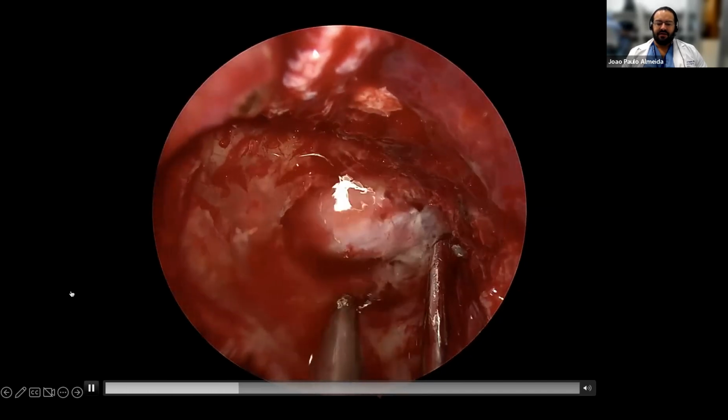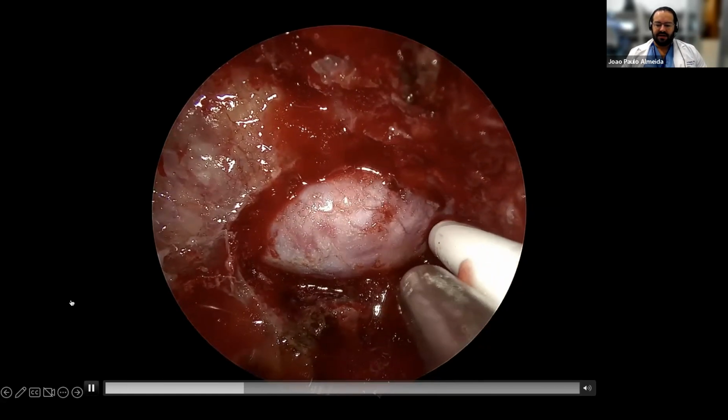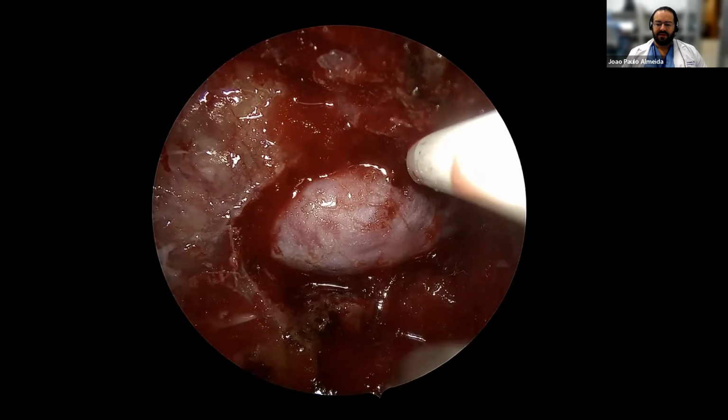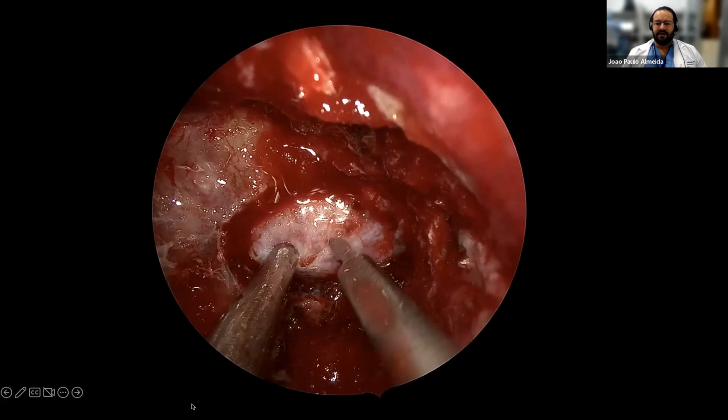What you see there, I got this from the lab, actually, to work a lot with double ball probes that help dissect. You see the Doppler. And what you see here, of course, this is the dura covering the pituitary. And then here you see bluish, this is the anterior face of the cavernous sinus. And right here, you can't see very well because I really didn't fully expose, which is one of the limitations I had for maneuverability. But I had part of the clinoid ICA exposed on the left, but I don't have a full exposure as I would favor for a case.